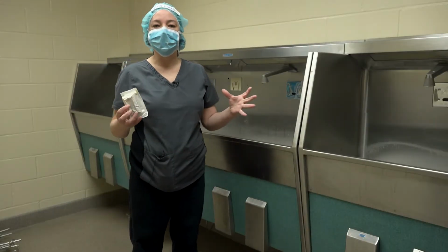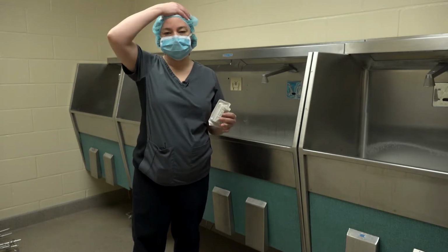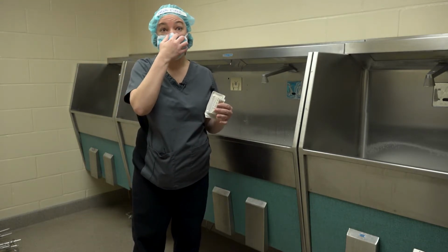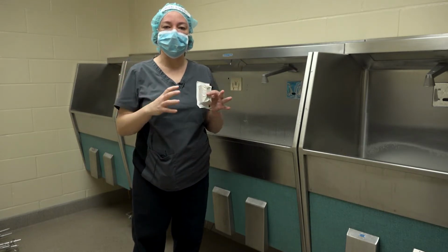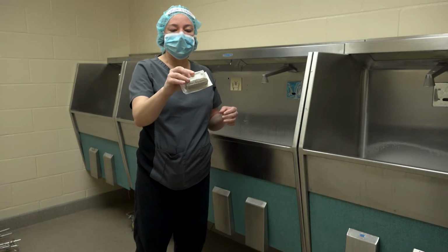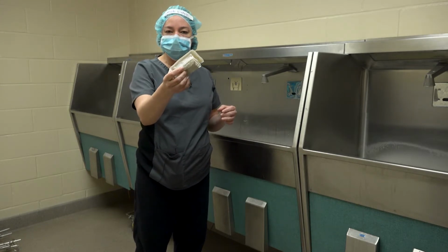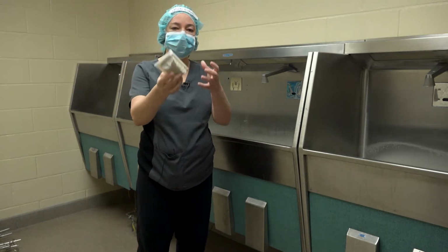So scrubbing, we're on to the scrubbing part. This is a super important part. Double check you've got cap on, mask on, because you can't go back into the surgery suite without these things on. So make sure you have those on when you start. You'll find the medication soap embedded sponges over on the wall. And so you grab one of those.